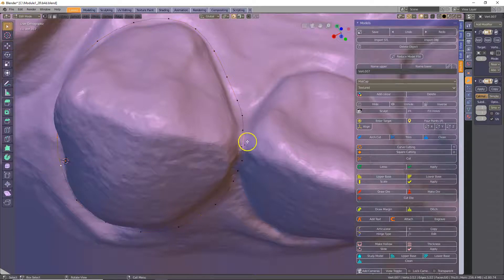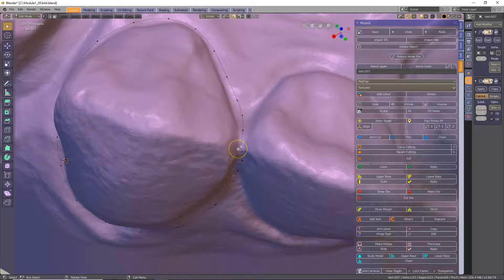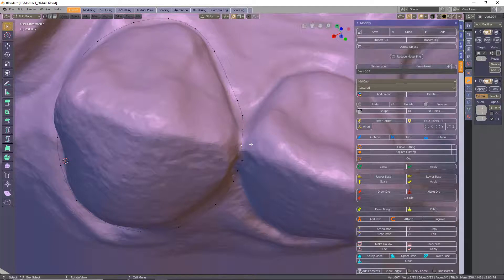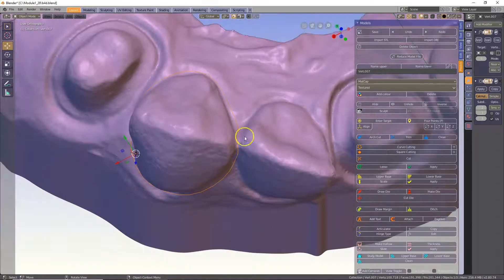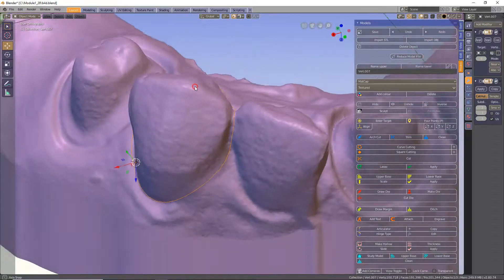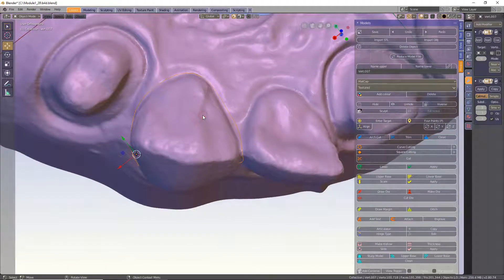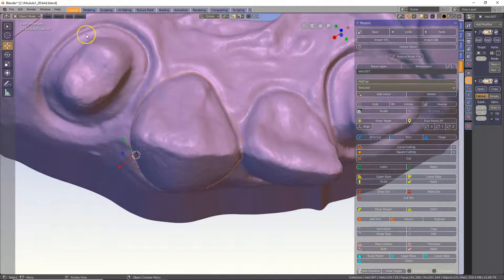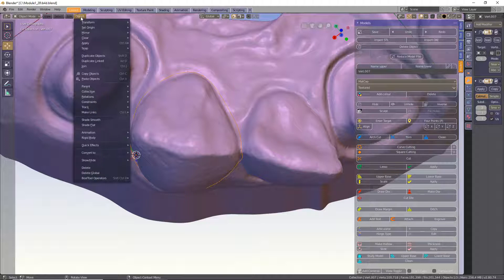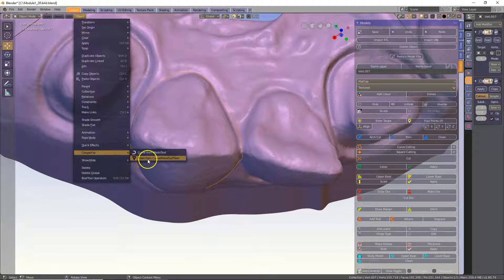Then tab into edit mode and you may have to select the vertices and press Q. Q will move it 0.2 mm away from the surface, then tab again. Now we need to convert this into a mesh. This is easily done by going to the objects menu and clicking convert to mesh.